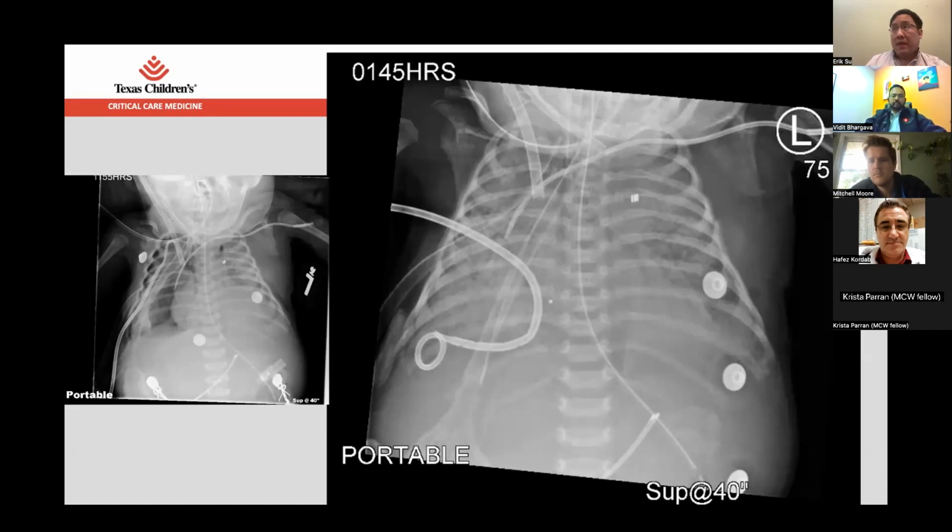Or the kid who just got intubated and you see it go through the cords, but maybe it's this kid who's been struggling for a long time and they're still desaturated and they've got such bad pneumonia that the end-tidal isn't changing color and everyone's just screaming at you, just get the tube out, just get the tube out. But you put the ultrasound under the diaphragm and you bag real hard. Well, not too hard, sorry. And you see the diaphragm dropping. It's like, no, we're in. We just need to bag the lungs back up. There's things where we don't need to replace X-ray, but we can definitely get to the patient a lot faster.